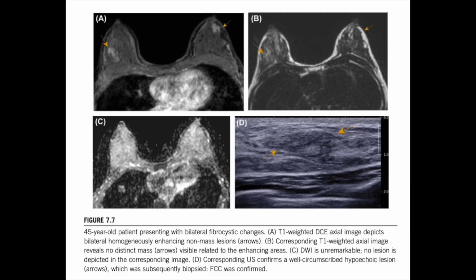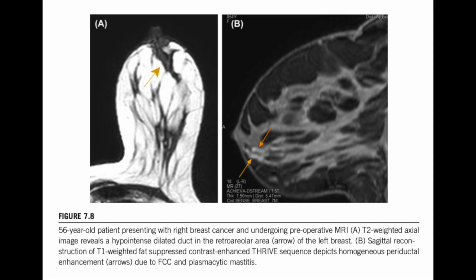So a low ADC value means restricted water, which points toward malignancy, and benign tissue... Benign tissue is looser. The cells are more spread out. Water can diffuse freely, so you get higher ADC values. And there's a specific threshold for this, right? There is. Researchers have found that ADC values greater than 2.1 times 10 to the -3. Okay, a very specific number. A very specific number. If you see that, especially combined with good BI-RADS descriptors, you can be pretty confident the lesion is benign. That sounds almost definitive.